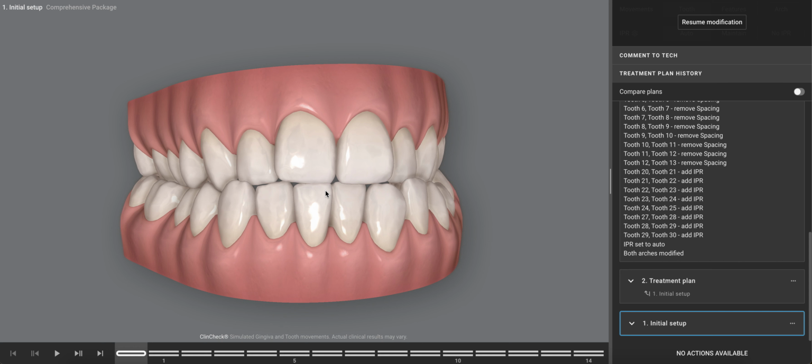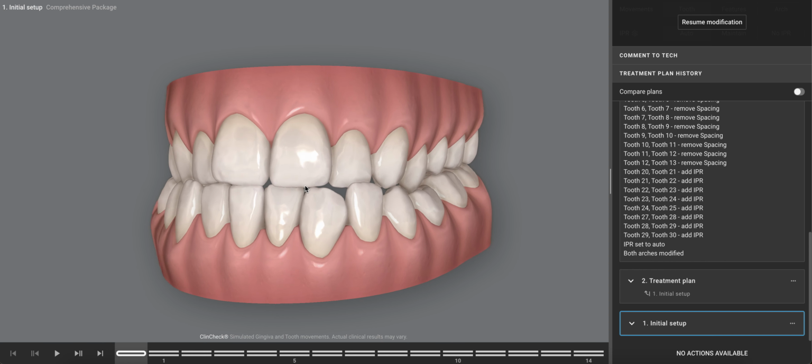Invisalign case. Patient wants to straighten their teeth. As we can see in this photo here, it's going to be a rather complicated case to execute, whether or not we resolve all of the issues, some of the issues, or just a few of the issues. So I'm going to share with the audience just a little bit about what the patient's looking for. Patient's just looking to straighten their teeth.